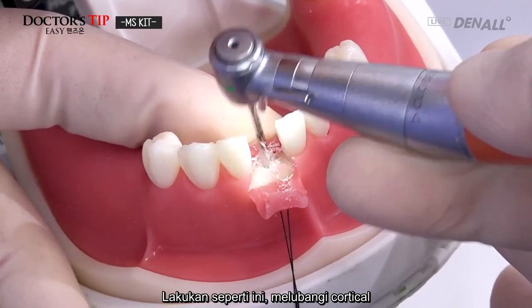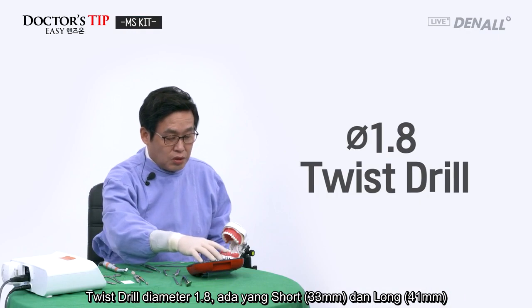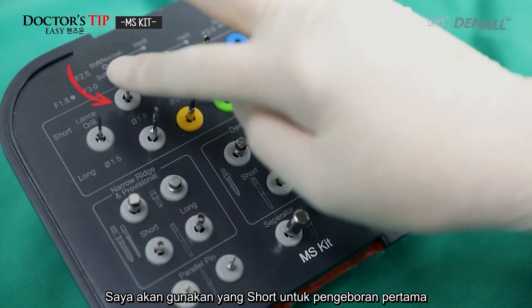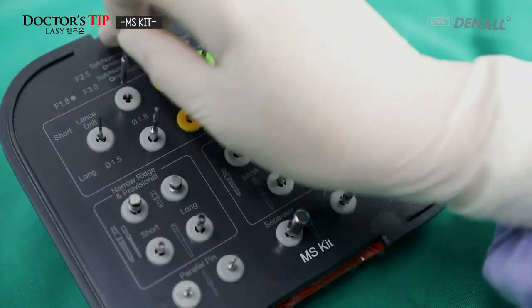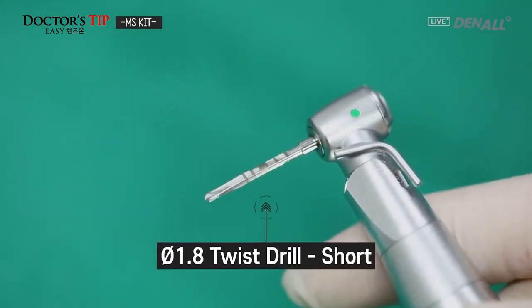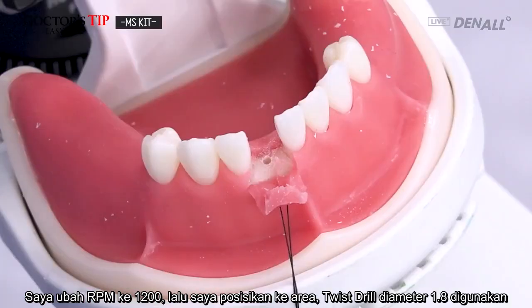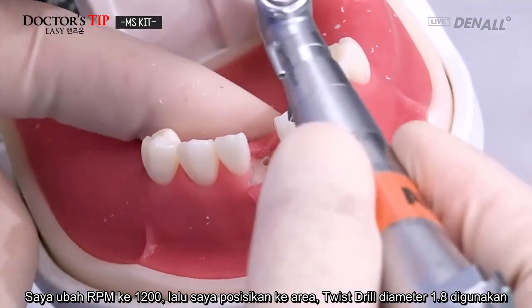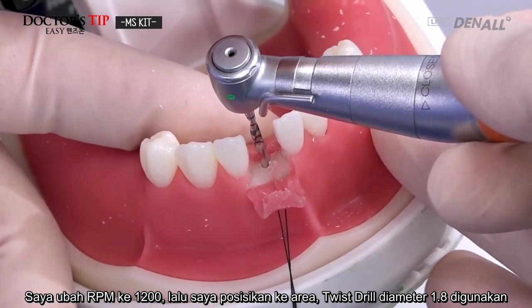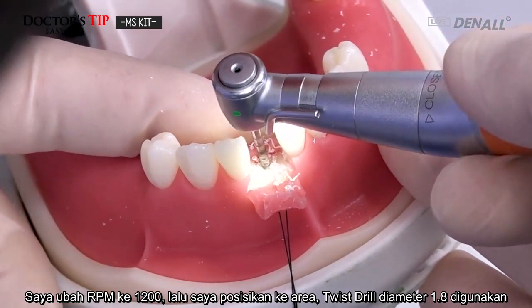put a hole in the cortical, and use the 1.8 diameter twist drill. You have short and long versions. I will use the short for my first drilling. So the 1.8 twist drill, like this. RPM, I changed to 1200. And as you can see, in the area I placed, I position it. And the diameter 1.8 twist drill is used.